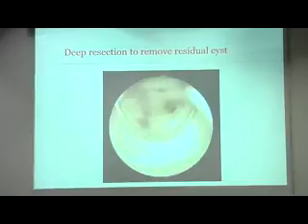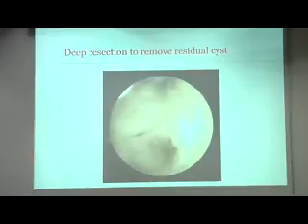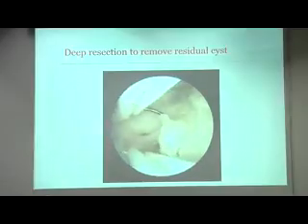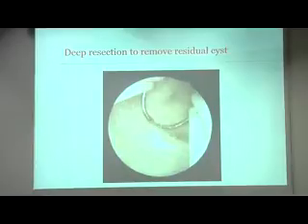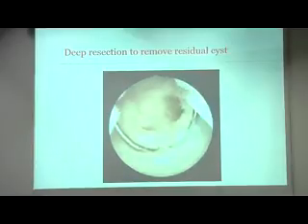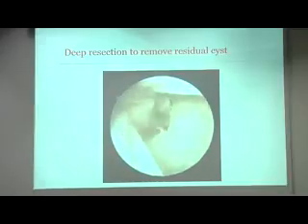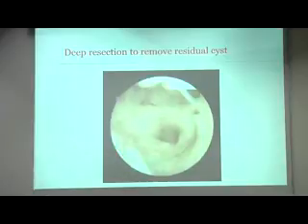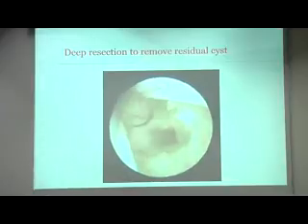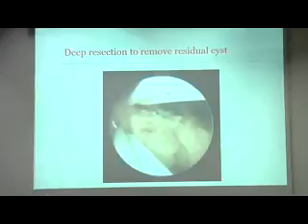And it will bleed because it's adenomyosis. You've seen the vessels, how big they are. So you need a good instrument which can coagulate, and you need to remove exactly the wall of this cyst, which is technically not so easy. So this is microsurgery of the womb. This is ambulatory surgery. The patient leaves the facility 1 hour after the surgery. But you need high-tech instrumentation, good organization, and a good team. Not only the surgeon, the nurses, very important.